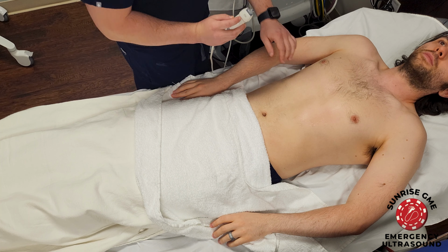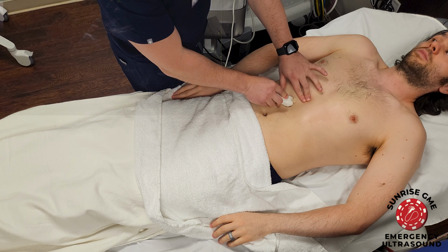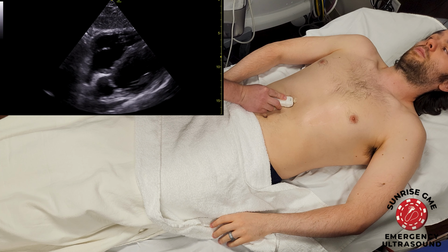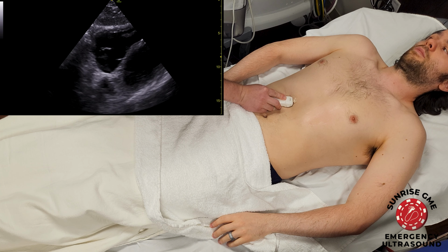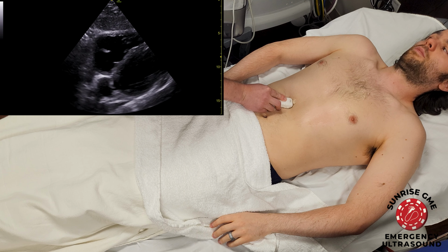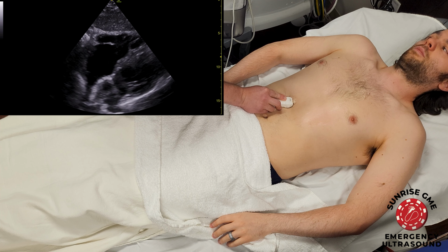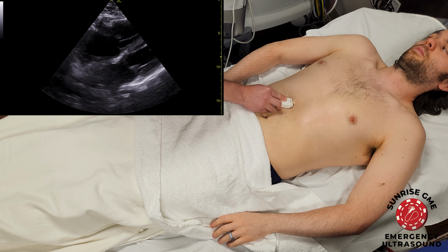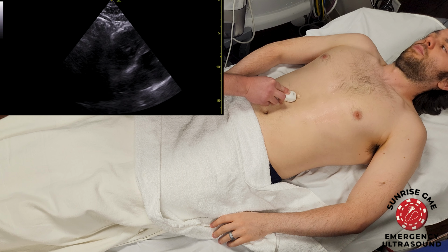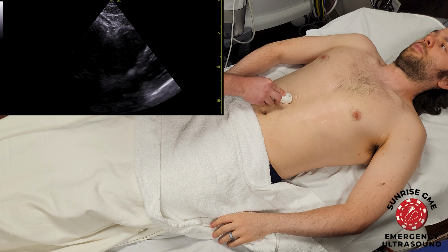Next, move to the subxiphoid area. We recommend that you place the index and middle fingers of your non-scanning hand against the patient's xiphoid process and then place the probe immediately caudal to your fingers, laying it as flat as possible. Placing the probe firmly into the patient's xiphoid process is often uncomfortable, as well as producing substandard images. It may be helpful to have the patient do an inspiratory breath hold to bring the heart further down into view. It may also be helpful to move the probe to the patient's right to better use the liver as a sonographic window.